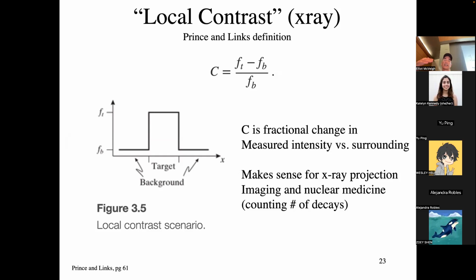Okay, contrast is how different the amplitudes of the signals are in different places in the image. So ideally, if I'm looking for a tumor in someone's liver, say they have a primary tumor somewhere else in their brain or their breast, and you look in their liver and ask, do you have anything going on in your liver? You want to have high contrast. You want the signal of those cells to be much different than the signal of the normal liver cells, right? So that when you look across the field of view, you go, this cluster of pixels right here has a much different signal, right?